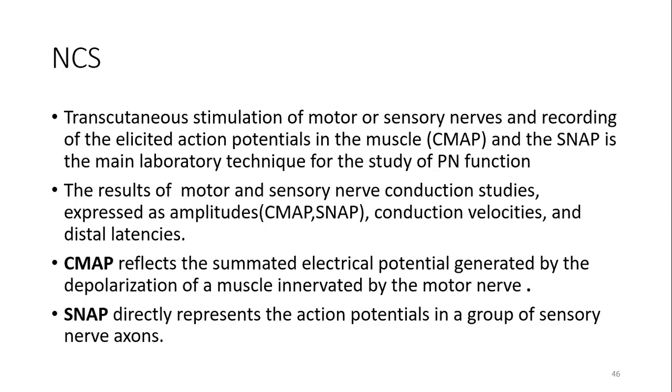The nerve conduction study can study the large myelinated A alpha, beta or gamma fibers. Those fibers are studied by nerve conduction studies. The small peripheral fibers are not going to be studied by this. There are other ways we can deal with small fibers, small sensory or autonomic fibers.